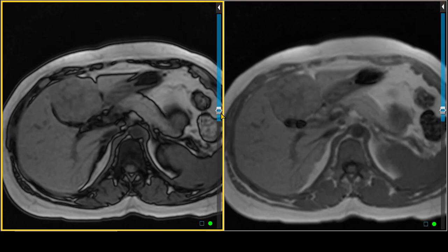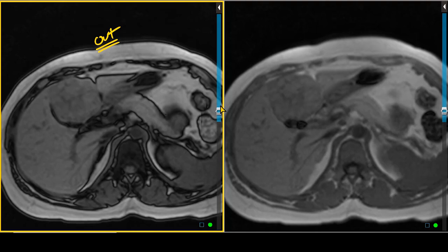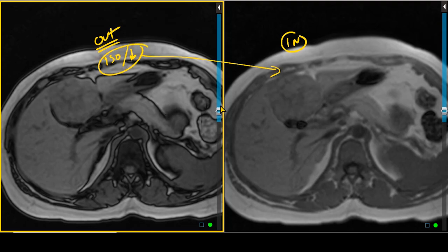The next set of sequences are the T1 in and out of phase images. On the out of phase image, the lesion is iso- to slightly hypo-intense with respect to liver parenchyma. Similarly, on the in-phase image, it looks iso- to slightly hypo-intense. There are no areas of diminished signal on the out of phase images to suggest fat within this lesion, and there is no increased susceptibility artifact on the in-phase images.